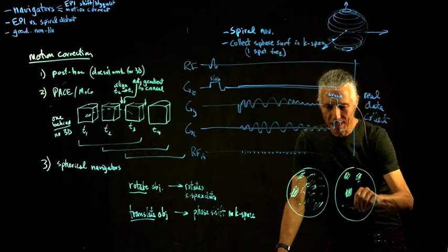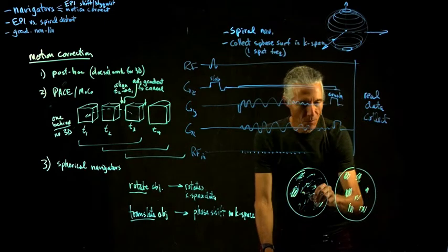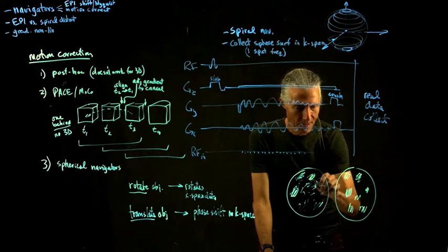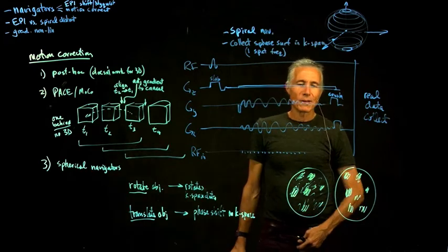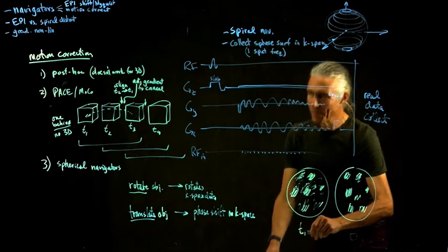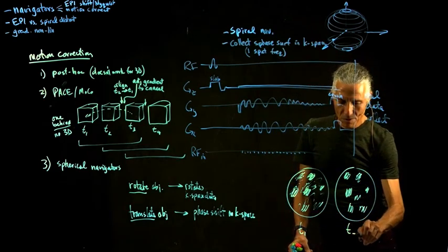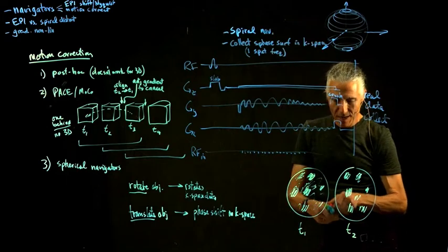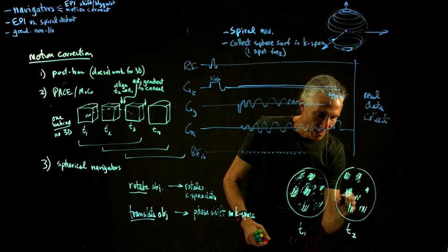We can essentially just collect some data for the first scan, figure out where the little clouds are, and then collect, say this is time t equals 1, and now we get t equals 2, and then we say, oh, actually I can see that basically we've rotated this guy a little bit.